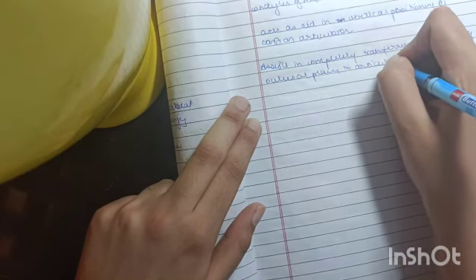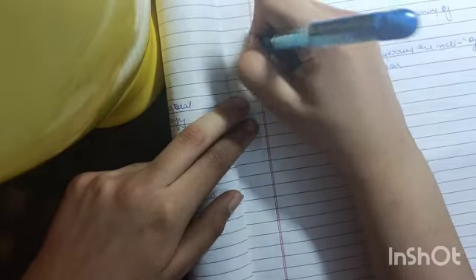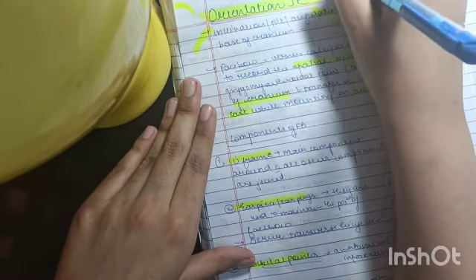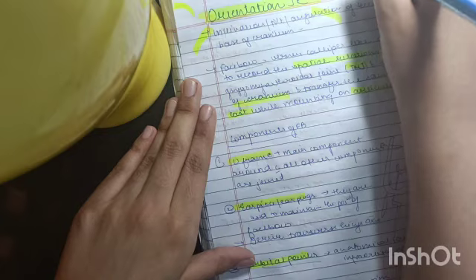Now, one more thing that you must remember is that the orientation jaw relation is recorded in the sagittal plane. So this completes orientation jaw relation.